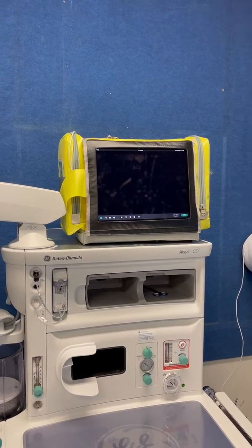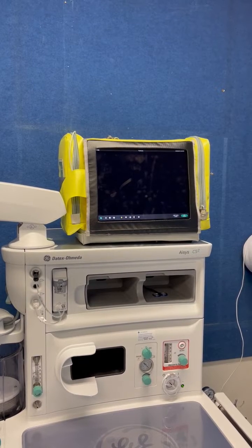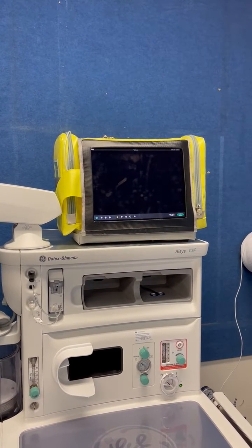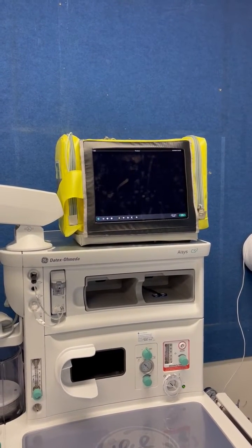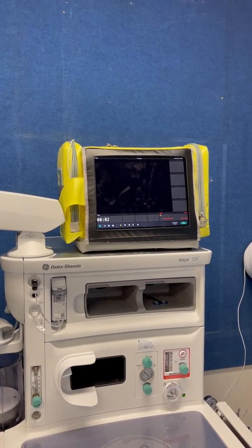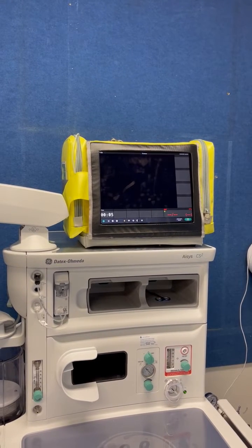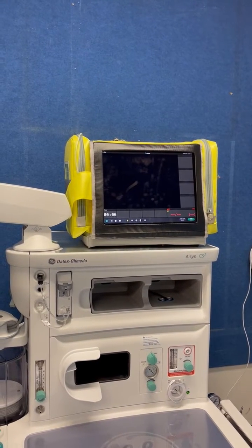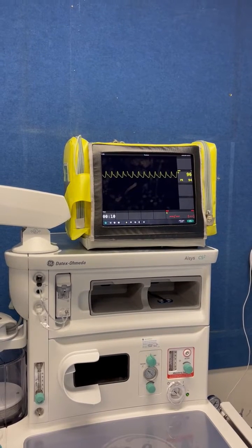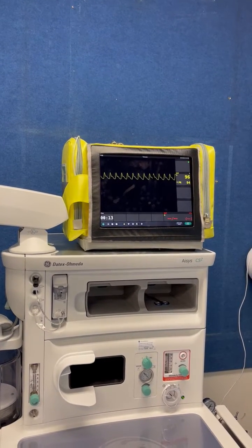Kia ora te whānau. I'm just going to talk you through the monitoring for your OSCE. This is going to be your patient monitor, and it will look like this when you start your assessment. When you put the pulse oximeter on the patient, that will appear on the screen.